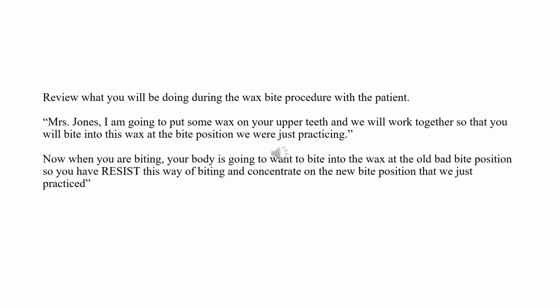The problem is that your old bite, whenever you bite into something, you automatically bite in your old bite position, and you're going to have to resist that and stay in the bite position that we were just working with. It's very important for you to know that. Take your time, go slow, and listen to me as I talk.